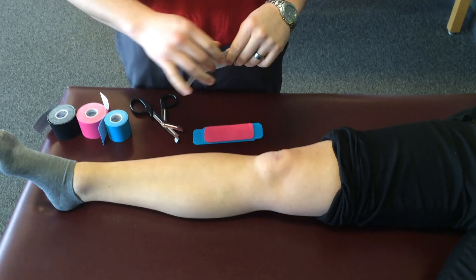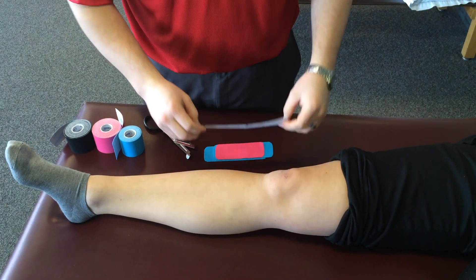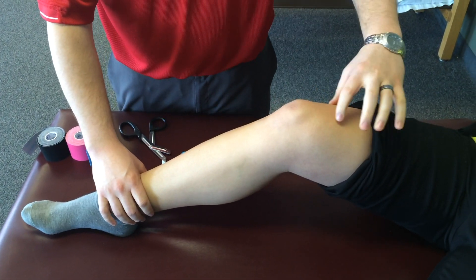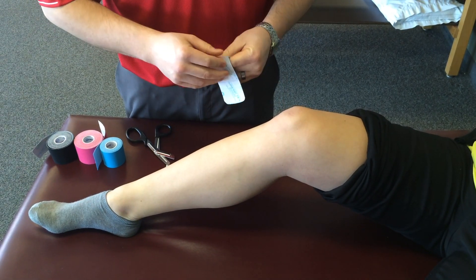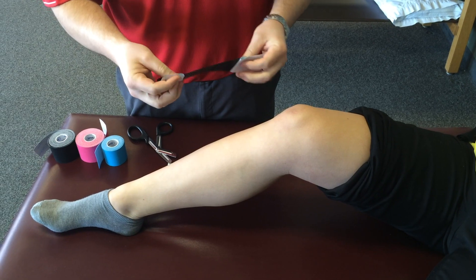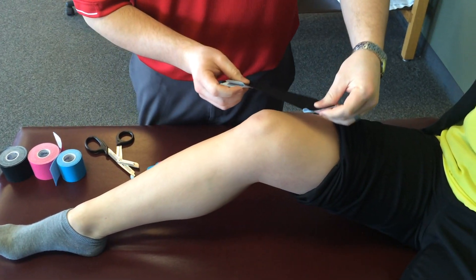Now Kinesio Tape is stretchy — I'm going to tear that right down the middle. You'll see I've got a little bit of motion to play with here. What I like to do is bring the knee up to a slightly bent position. That way I can apply the tape with the right amount of stretch, still allowing her to bend her knee completely and straighten it completely. The first strip I'm going to apply is going to be in kind of a curved formation here across the outside of the knee.